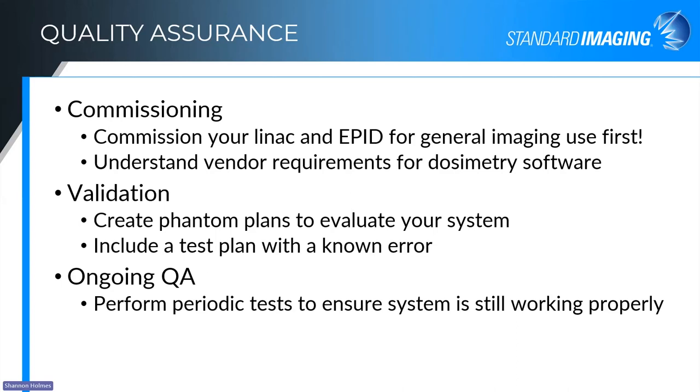And then the second part of commissioning a new dosimetry system for your EPID is to understand your vendor requirements for that dosimetry software. Based on the algorithm being used by the software, and whether you're trying to do beam matching for your machine or just implementing a more generic beam model for your type of LINAC, there will be different requirements for commissioning your system. So do your due diligence beforehand, understand what's required, and make sure you've got prerequisites in place before you step into the commissioning process.